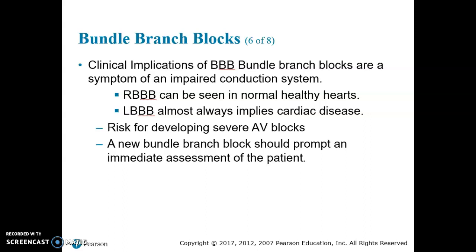is there because you've diagnosed that they've got that left bundle branch block, and then 5 years down the road they have a heart attack, you might not be as quick to catch it because you think it's that left bundle branch block is what I'm trying to say. So be careful with that. So know that these bundle branch blocks, with a left bundle branch block, may cover up a heart attack. You may not be able to see a heart attack with this.